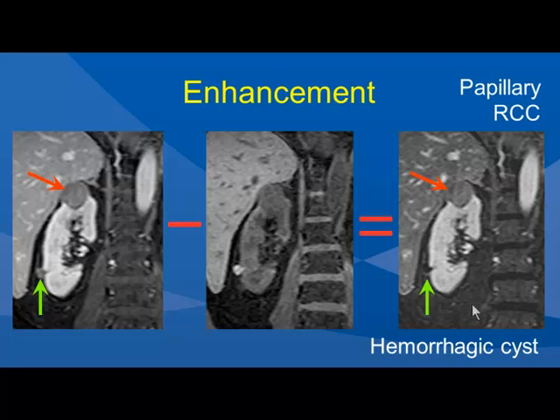So again, just by looking at these images, you can assess the presence of enhancement very rapidly without having to do region of interest analysis and measuring signal intensity.